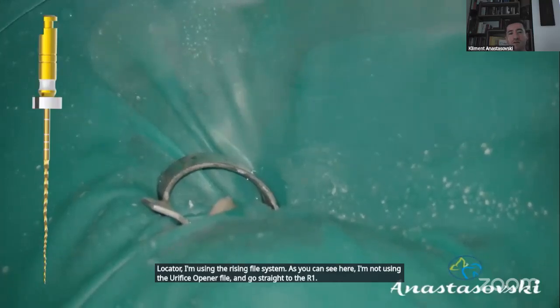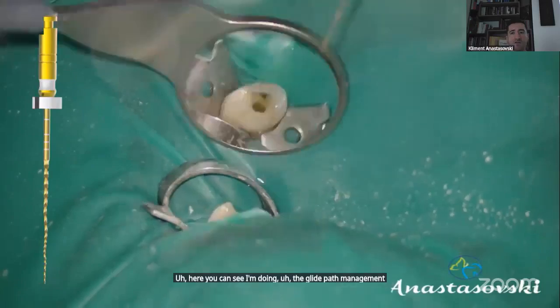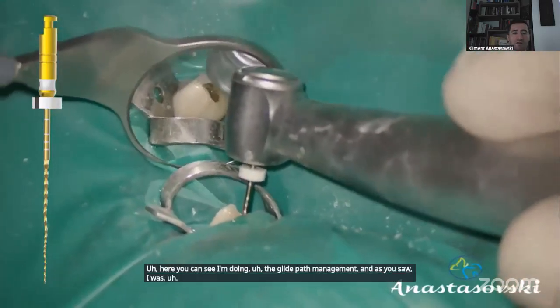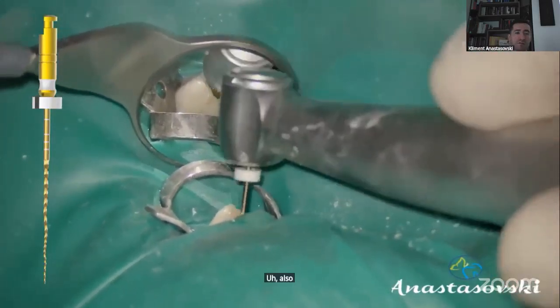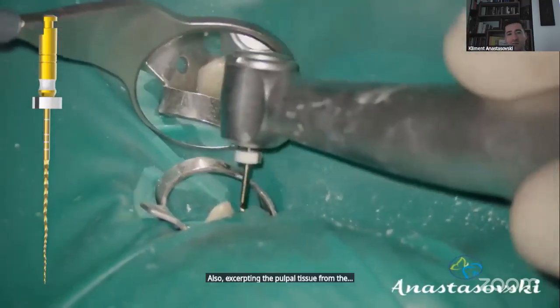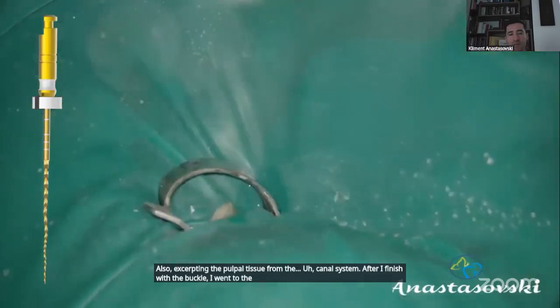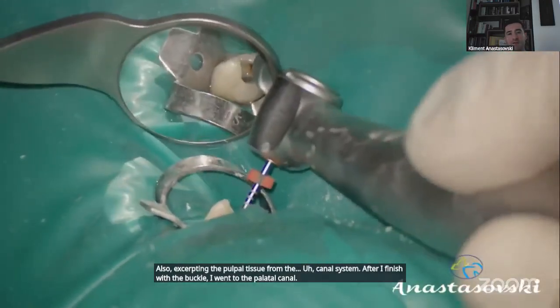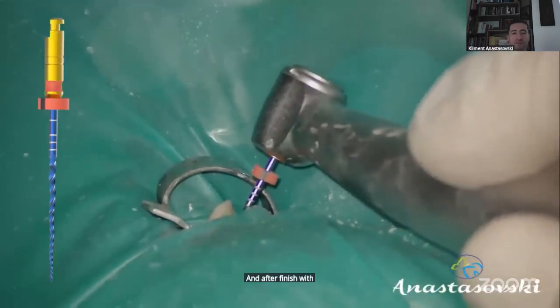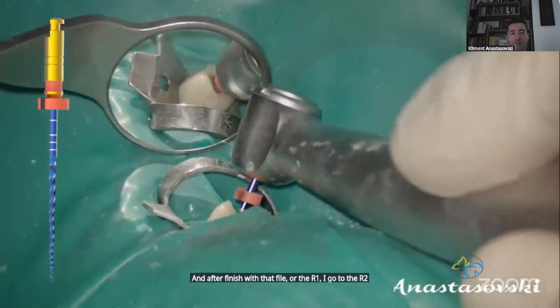Here you can see I'm doing the glide path management, and as you saw, I was also extirpating the pulpal tissue from the canal system. After I finished with the buccal, I went to the palatal canal. And after finishing with the R1, I go to the R2 file from the RISING.